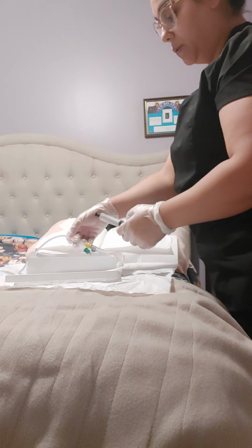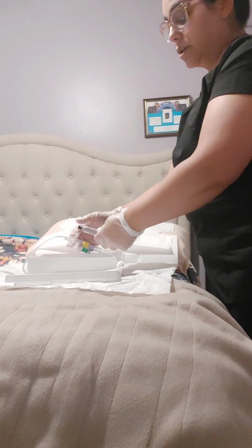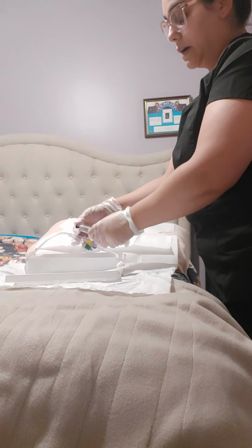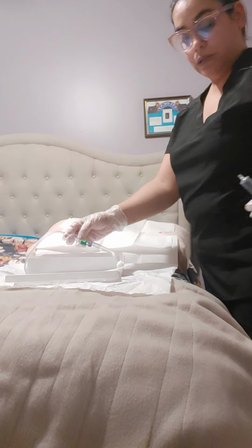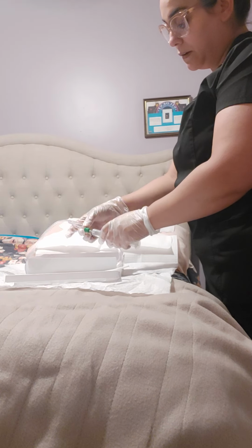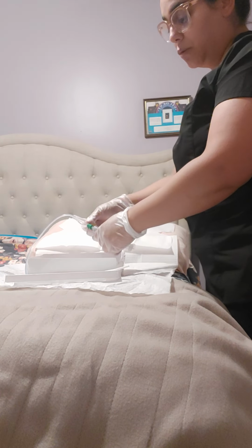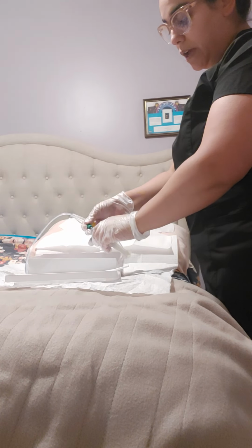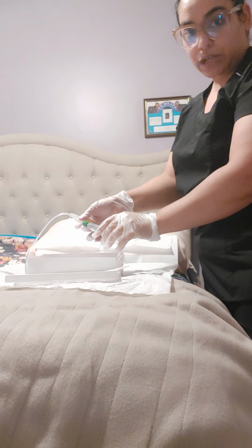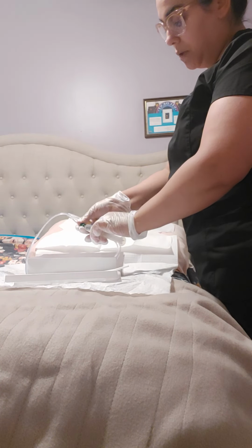I also like to prepare my balloon ahead of time because once I start the procedure, I will only have one hand to work with that is sterile. So get rid of that. Put it into my port all the way. And we no longer test the balloon just because evidence-based practice has shown that we can actually do more damage and actually defect the balloon while testing it.